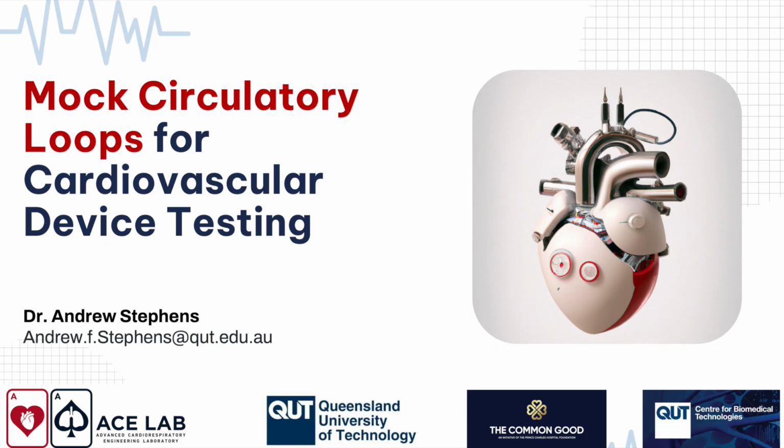So there are also advanced features that we can put in our mock loop, a Starling mechanism, for instance, which automatically adjusts cardiac output based on requirements of the body, baroreflex, coronary regulation, cerebral regulation. All of these things are mechanisms that our nervous system and the chemical receptors in our vasculature are automatically doing that we can mathematically model and then impose on our mock loop. And we're going to look at an example of that through the Starling mechanism. And all of these things change based on whether the patient is healthy or in a disease state.